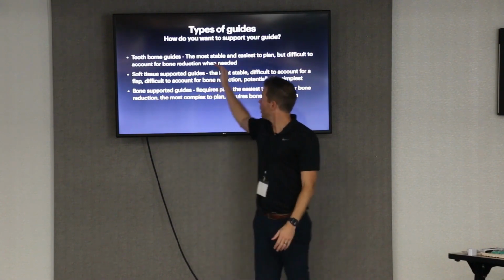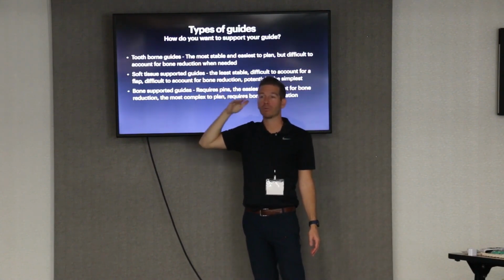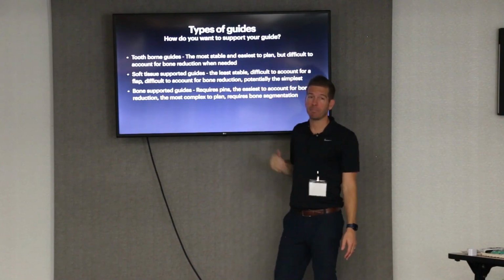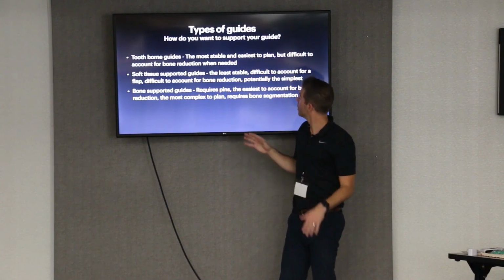So if we talk about these three, this is the one that I want to teach because it's the simplest. Because you guys are already doing tooth-supported guides for single teeth. So if we can just build upon that and plan full arch cases with teeth being our supports, it's going to be a lot simpler.